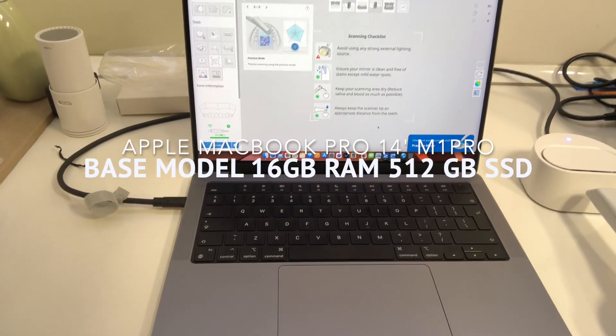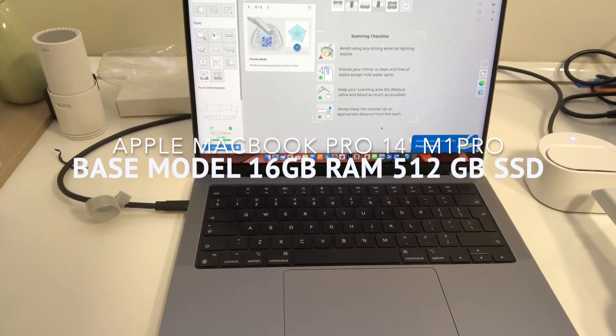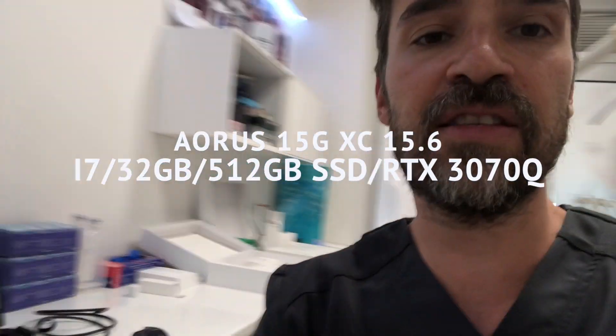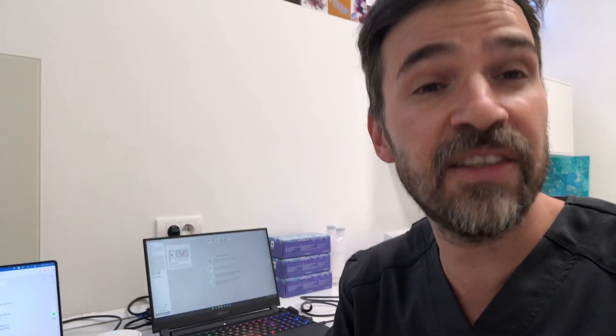Here I have the MacBook Pro which I'm mostly using these days. This is a MacBook Pro 14-inch M1 Pro chip with 16 gigabytes of RAM — this is the base model. And here I have the Gigabyte Aorus, a gaming laptop with the most powerful i7 processor, 32 gigabytes of RAM, and most importantly an RTX 3070Q graphics card with 8 gigabytes of RAM. I paid a little more than two and a half thousand euros for it, and the MacBook was exactly 2000.